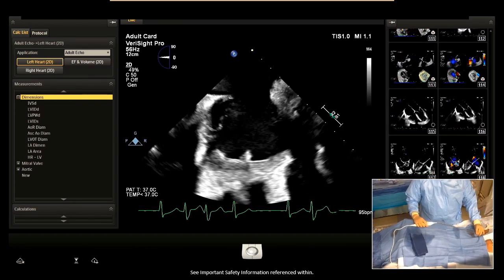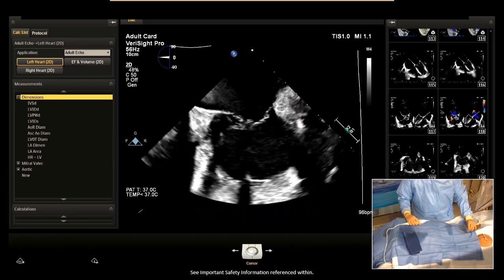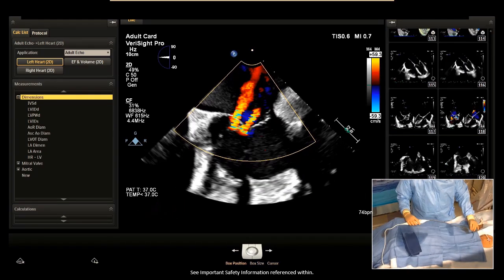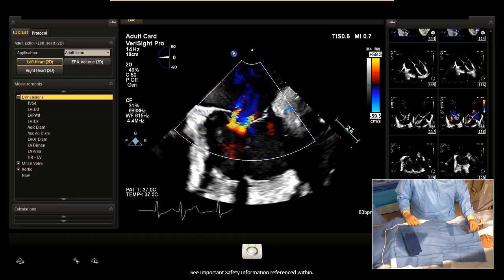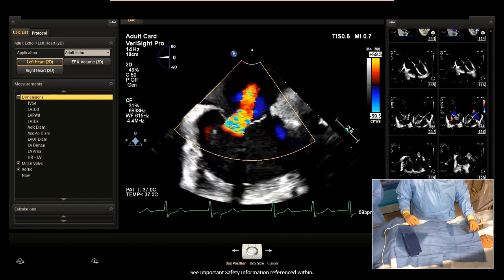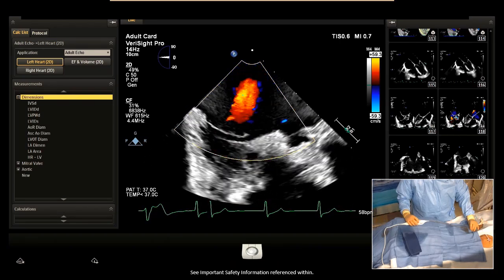Yeah, it looks beautiful. The aorta right now is about 3 o'clock or so. So this is a nice home view at 0 degrees. Okay, great. So you want to go ahead and get some color on and make some initial measurements. If you want, I can clock here. This is me clockwise rotating. This is me counterclockwise rotating. There's all that TR that we were looking for.